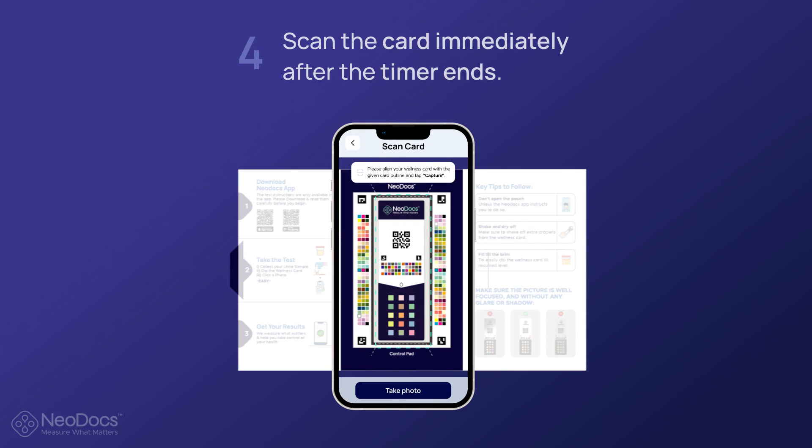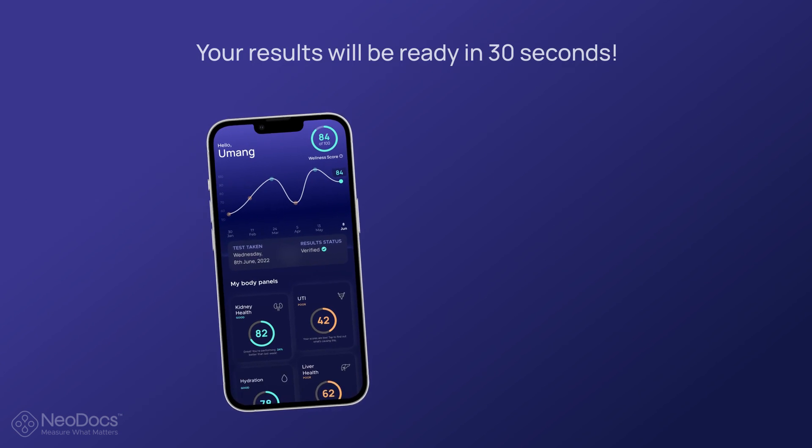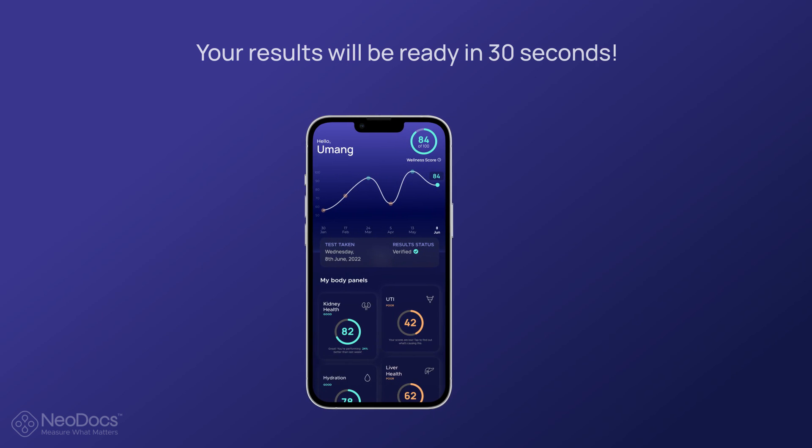Scan the card immediately after the timer ends and you're done. Your results will be ready within 30 seconds.